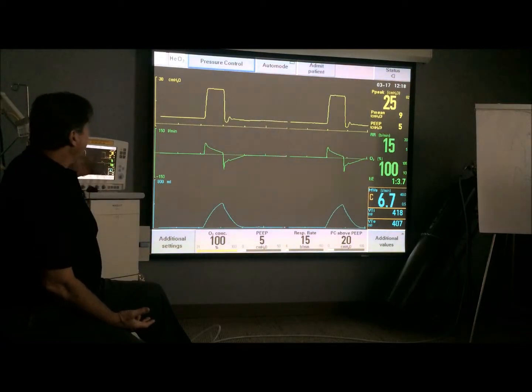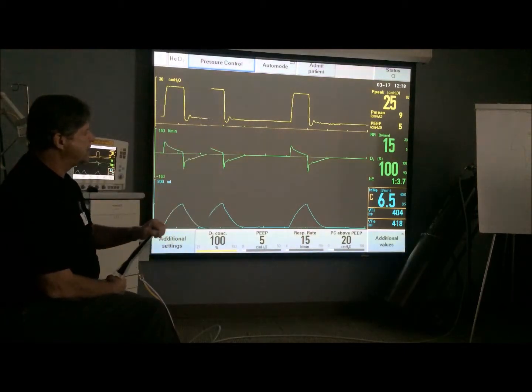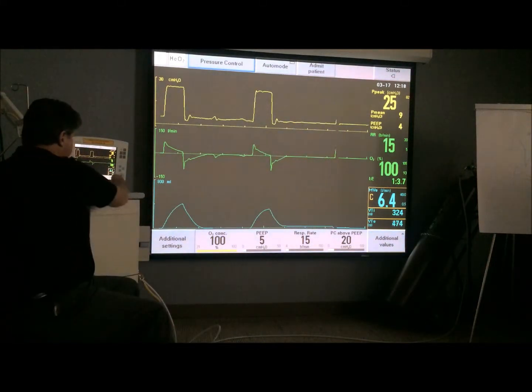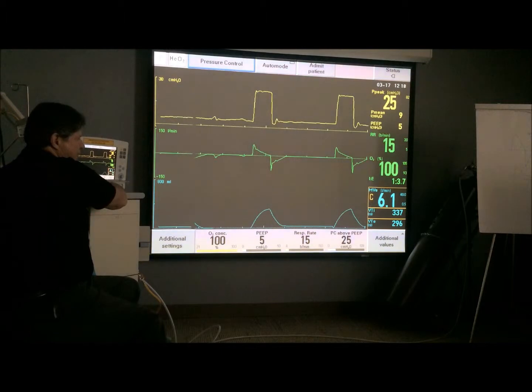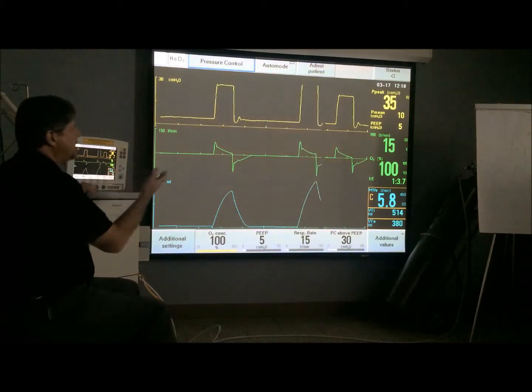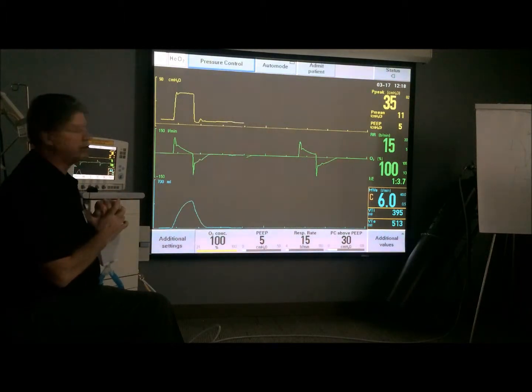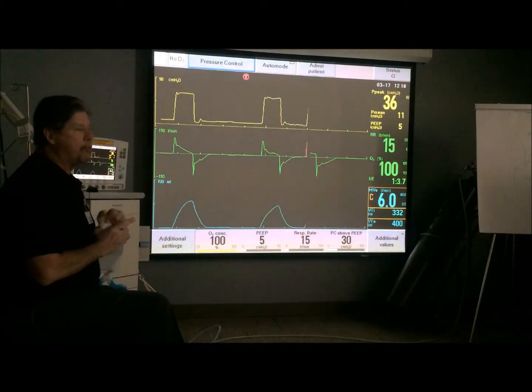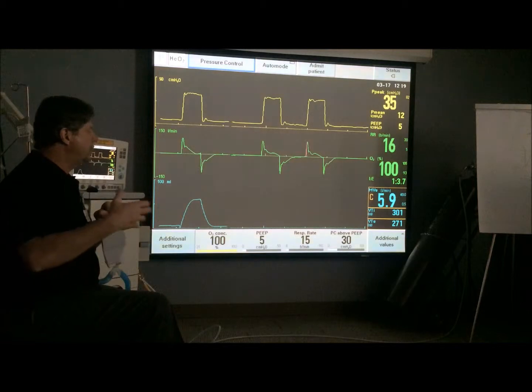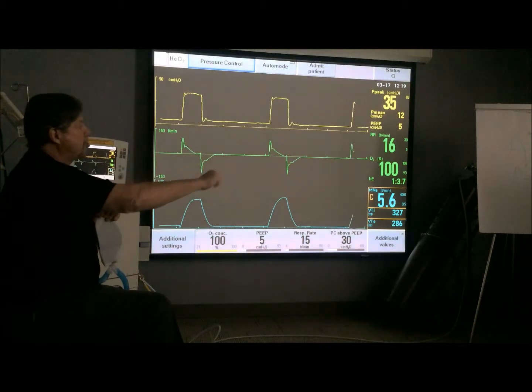So when we're in pressure control, if the doctor said, well, yeah, you can use pressure control and adjust the pressure to maintain a tidal volume of 400 cc's, but his compliance is going to get worse over time, and you can adjust the pressure to maintain that 400 cc's, but as you adjust it, I don't want you to go any higher than, say, 35 centimeters water pressure peak before you call me and let me know that you're no longer able to deliver a 400 cc tidal breath. That will tell me that the compliance has gotten so bad now that we have to take some other measures. But at least I know that I'm not going to be giving him too much pressure because I've ordered you to stop turning the knob at 35.